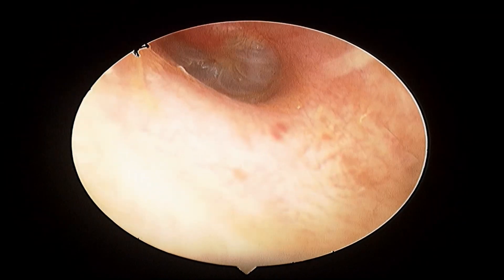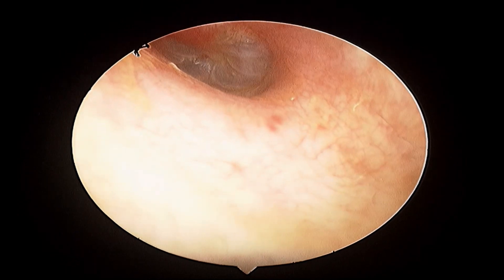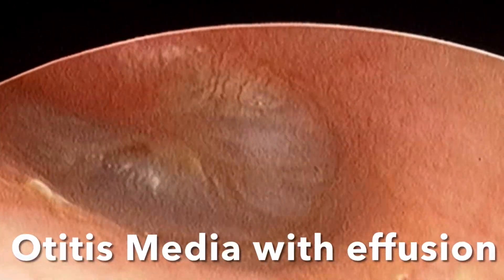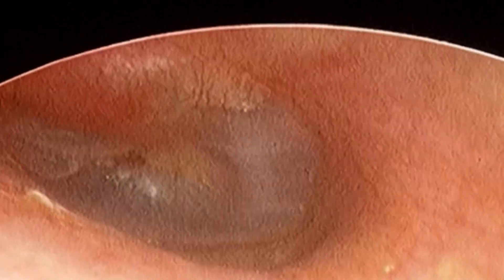Welcome to the ENT channel. As you can see, multiple air bubbles behind an intact eardrum — water accumulation following an attack of cold. This condition is known as otitis media with effusion, or glue ear, and develops when the tube connecting the ear and nose gets blocked.